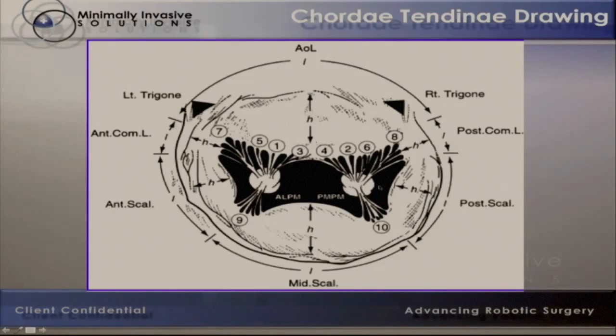But you notice how many cords are attached to the papillary muscles here? We determined that it was going to be far too expensive to have all of those cords attached accurately, when really all we needed was a couple of cords to be attached to be able to replicate the live tissue and to get the training effect from it.